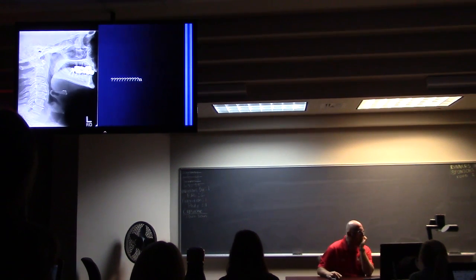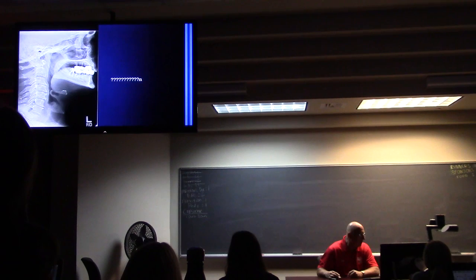Two, three, four, five, six, seven. Top of T1, so that's good. Anterior vertebral line, it's just not as smooth and straight, but again, it's a really old person. You can see they've got all these osteophytes. Posterior vertebral line, spinal laminar line, tips of the spinous processes.